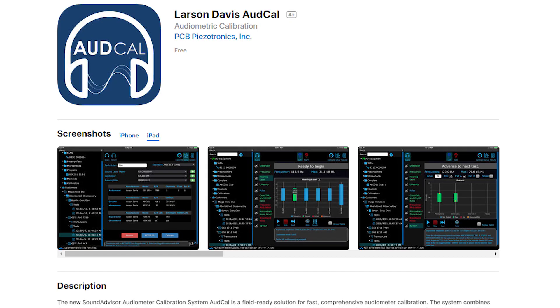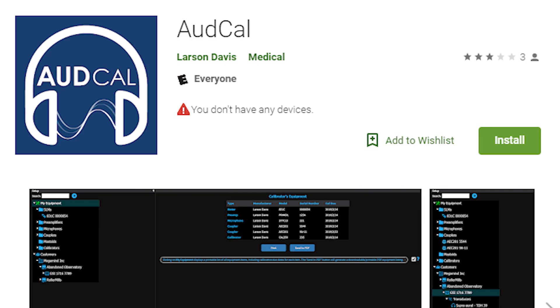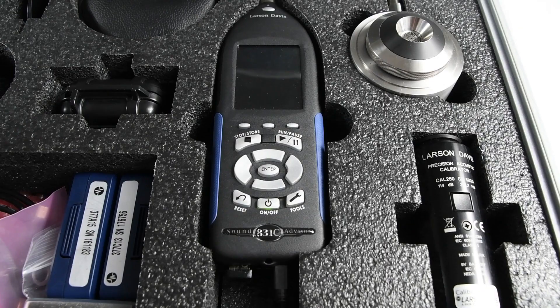Before you begin, download the Larson Davis AudCal app on your tablet, which is a free to download app from both Apple App Store and the Android Play Store.